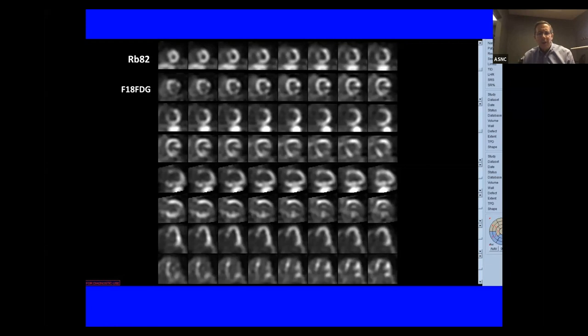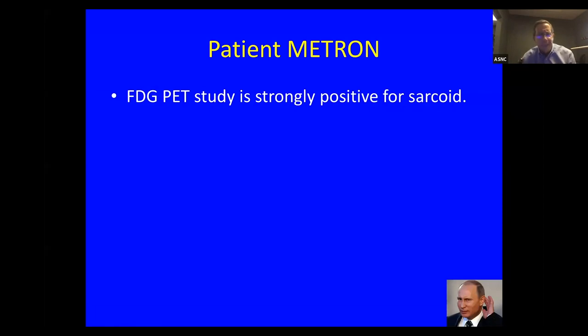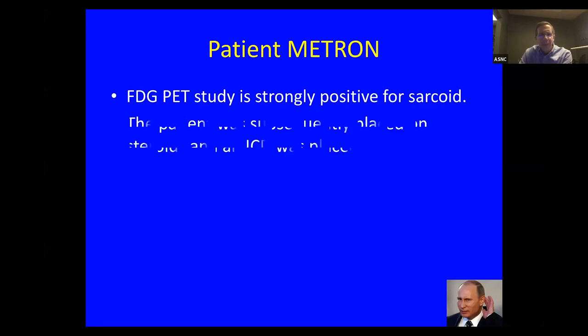Someone looking at a report for a stress test and doing a coronary angiogram might not think about it. Here's the color, it shows a little better. So I think in this case, it speaks to the importance of looking at your studies and thinking of the whole case, right? If the rounding cardiologist had looked at the MPI, looked at the cardiac cath, thought about this, they might have thought, no, there's a reason. This is not just a motion artifact that makes the MPI look funny. This is a funny looking MPI study. Given the clinical scenario, the diagnosis could have been made sooner.